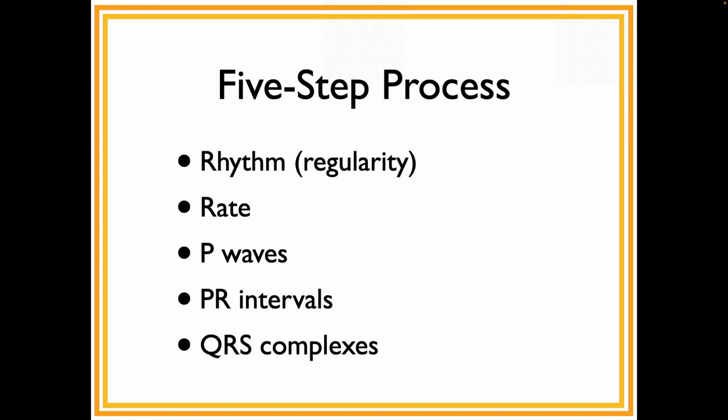But I highly recommend really, even though it can be a little tedious, understanding what this process is all about, because no matter how good you are, and I really mean that, no matter how good you are, who you are, from paramedic to cardiologist, at some point or another, you're going to see a strip and you're going to go, wow, what's that? I don't know what that is. And if you don't have this process committed to memory or some variation of the process that works for you, when you get to those moments, you're not going to know what to do. You're not going to be able to get an answer.